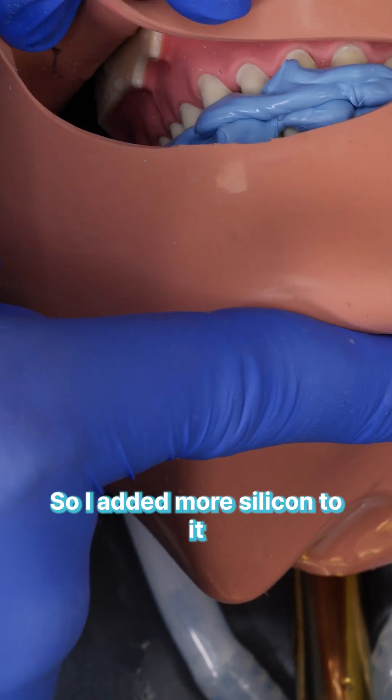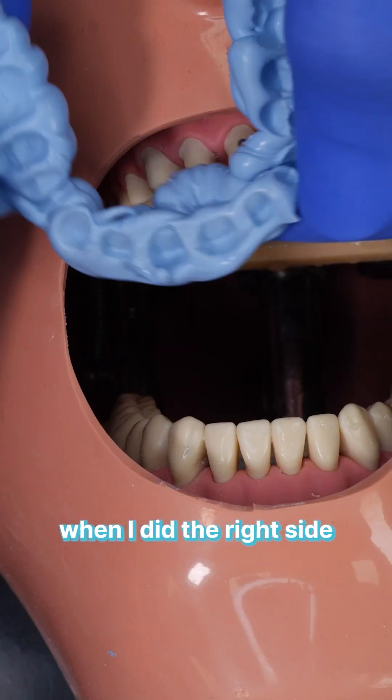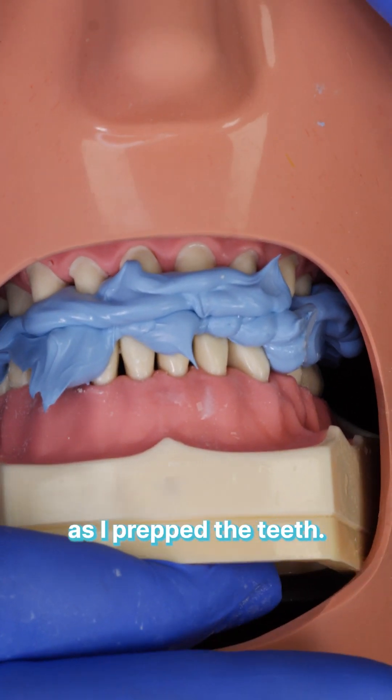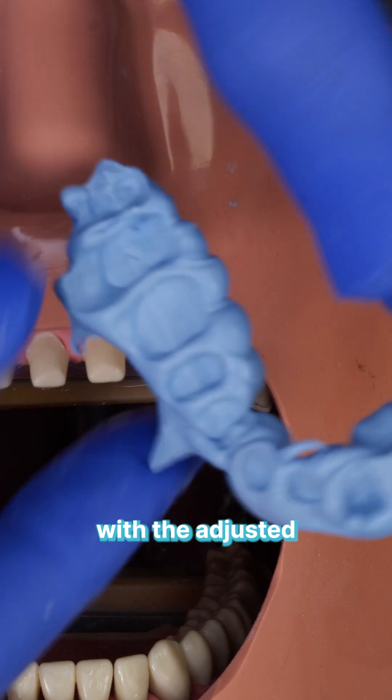Once I prepped the six anterior teeth, I relined the bite — adding more silicone and getting the patient to bite together. I did the same when I did the right side, and again when I did the left side, relining the bite as I prepped the teeth. This way you maintain exactly the bite you had with the adjusted temporaries beforehand.